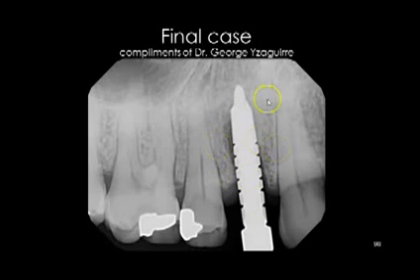And you can clearly see again, when you use your drill as a depth gauge, you can clearly see where your alignment is nicely in the x-ray. Again, because of the long shank in the mouth, you can see nicely your positioning of the drill.